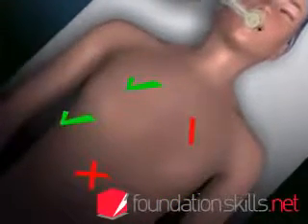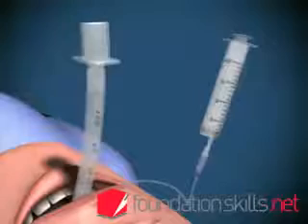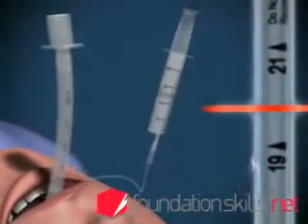If the tube is in too far, the right lung will be ventilated only via the right main bronchus. If this occurs, deflate the cuff and withdraw the tube 2 to 3 centimeters. Re-inflate the cuff and recheck the position.